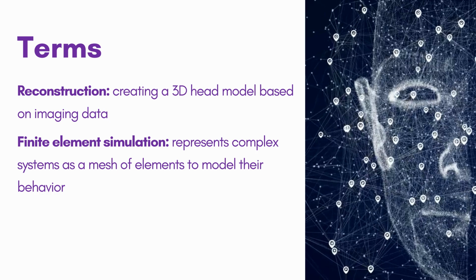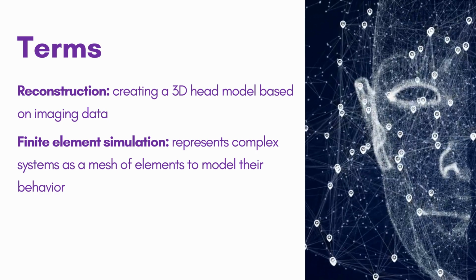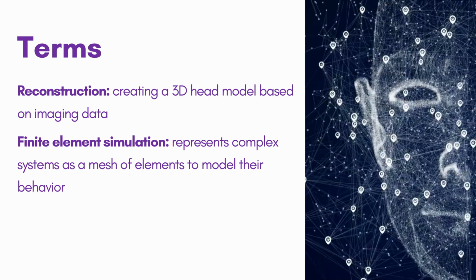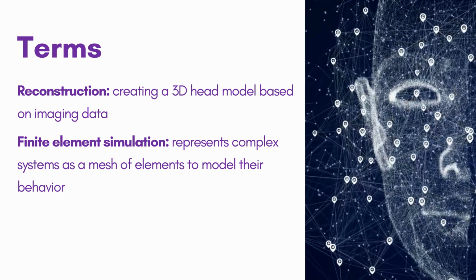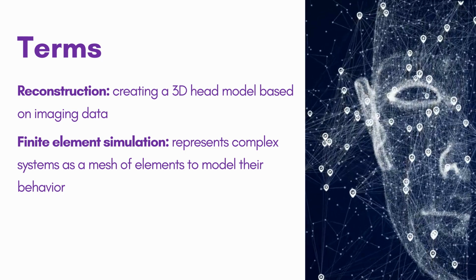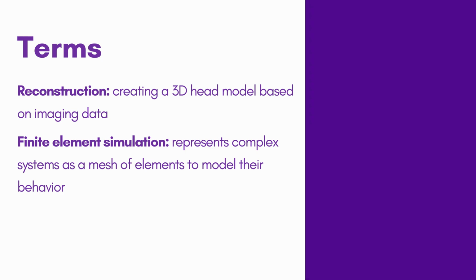Finite element simulation is a numerical method used to solve complex problems in engineering, physics, and other disciplines. It involves breaking down a large problem into smaller, simpler pieces called finite elements. So a complex system, such as the human head and brain, is represented by a mesh of these finite elements. The simulation uses properties of these elements and their interconnections to model the behavior of the system under various conditions. For transcranial electrical stimulation, finite element simulations are used to model the distribution of electric fields within the brain based on electrode placement, tissue properties, and other factors.